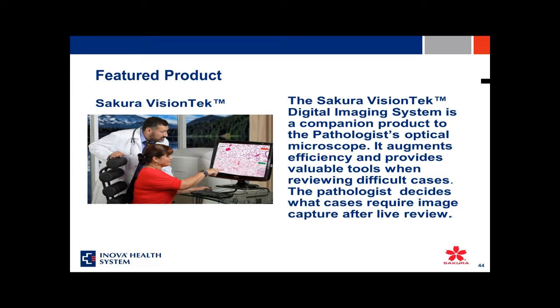Yes, there are a lot of FDA-approved algorithms that are ready to use. In those cases, you just have to verify that they work for your specimens and tissue types. But if you're trying to do it from out of the box, then there are a number of softwares available for tuning. We use the Aperio system for developing our algorithms, and we wrote our own in-house algorithms. As I touched on, at least for breast markers, an important factor is your cell feature detection parameters. The first step is to identify your tumor nuclei, differentiating them from your stromal cells and other kinds of cells. The second step is to bin those nuclei into positive and negative, and 2+ and 3+ categories. Those are the two filters that you would use.